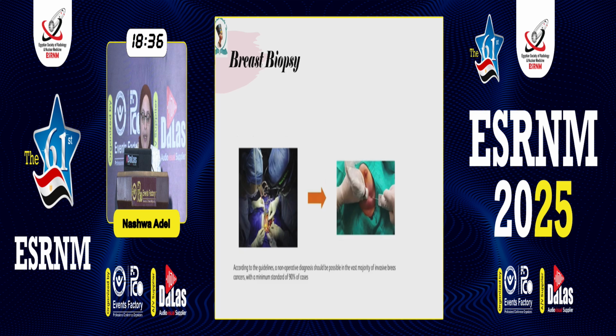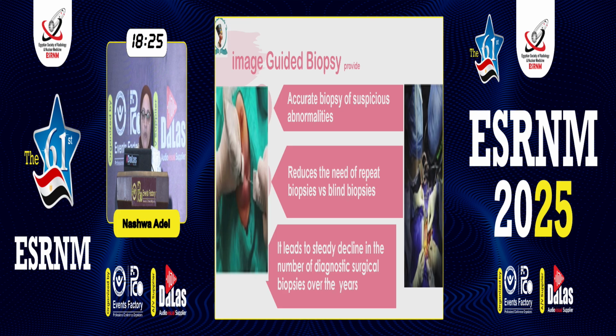According to the guideline, a non-operative diagnosis should be possible in the vast majority of invasive breast cancers, with a minimum standard of 90% of cases. Image-guided breast biopsy provides accurate biopsy for suspicious abnormality, reduces the need for repeated biopsies versus blind biopsies, and leads to a steady decline in the number of diagnostic surgical biopsies over the years.